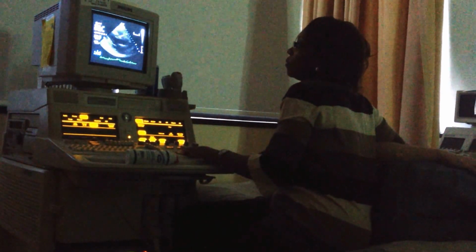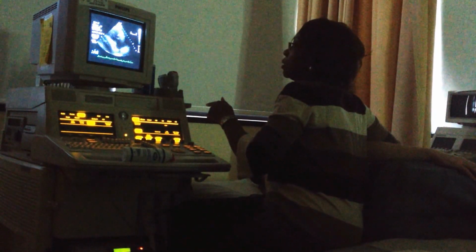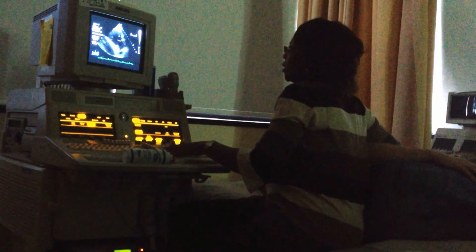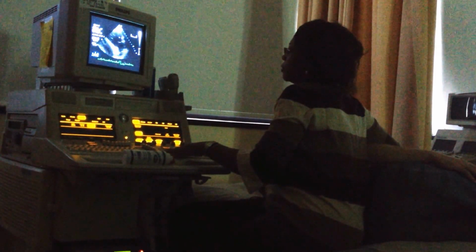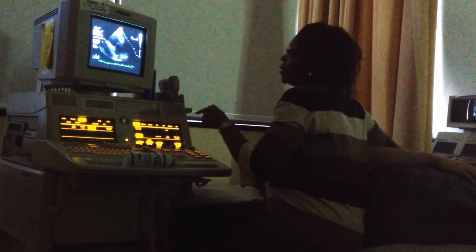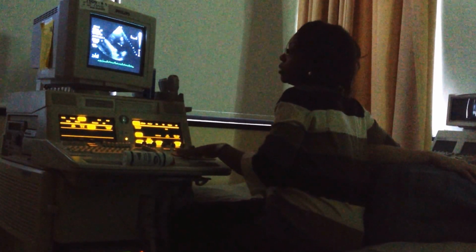And then if I tilt the tail up towards his nose, tilting the beam inferiorly, that is his, gosh, you got a good, I'm sorry, this is tricuspid. I'm sorry, that was pulmonic. This is the RVIT. This is tricuspid. So this is RV, this is tricuspid, this is RA.